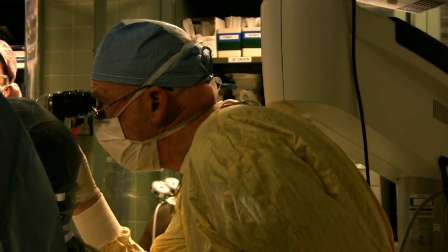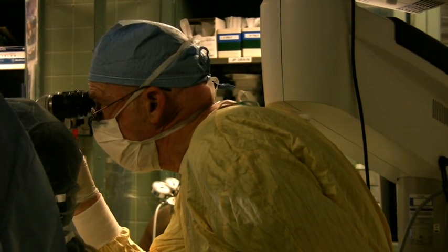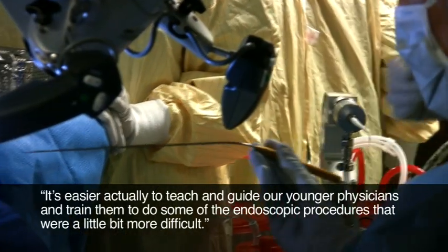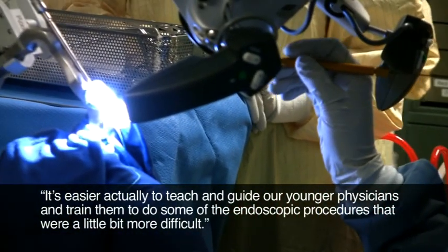It's easier to teach our physicians, and since we're in a teaching institution, it's easier to guide our younger physicians and train them to do some of the endoscopic procedures that were a little bit more difficult. There are certainly at least 30 percent of the cases I do that I would not be able to do without it, again because of that flexibility — it allows me to get into tighter spots. The system has really provided a whole new area for us to benefit our patients, and the use of the fiber has enabled us to do more procedures than we could in the past.